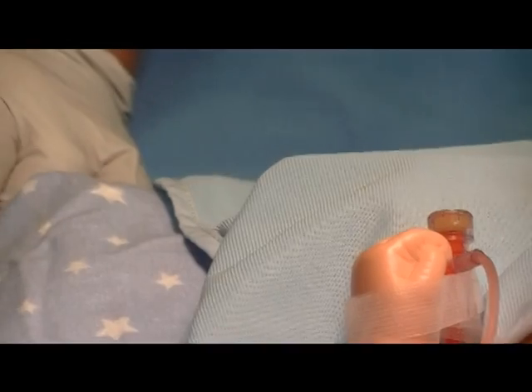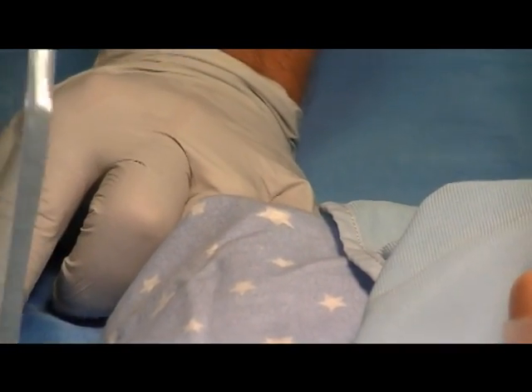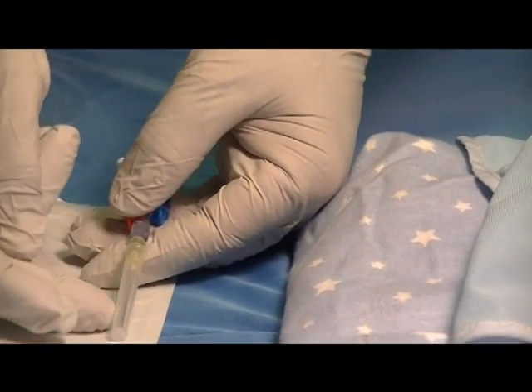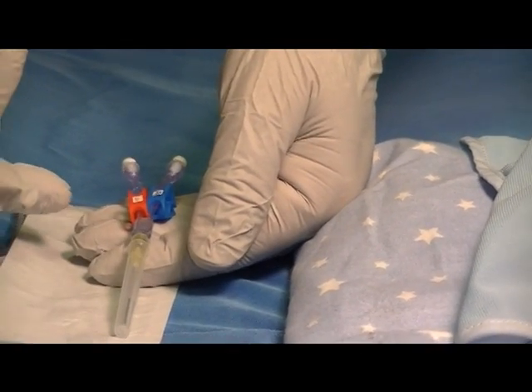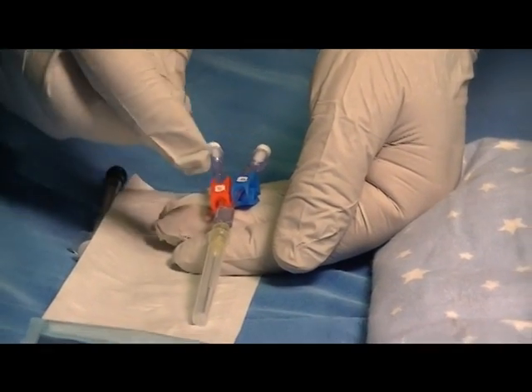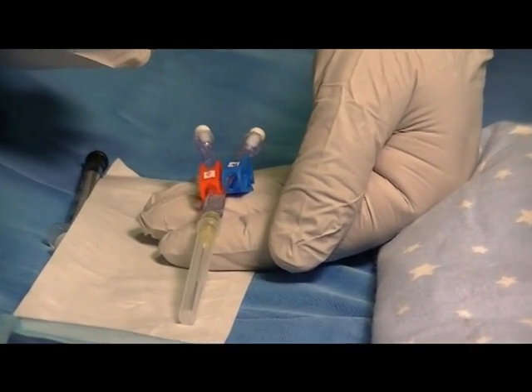Next, open the Humi Microdraw device and inspect it for integrity. These sterility covers should be in place over the blunt tube. The white vent caps should be in place on the lines, and the red and blue clamps should be present.